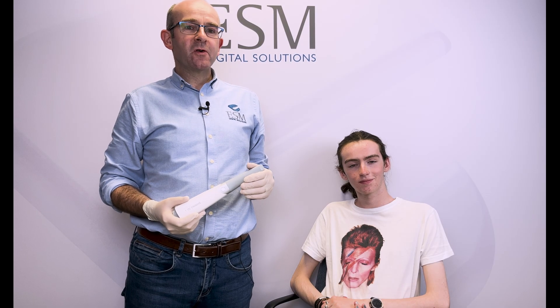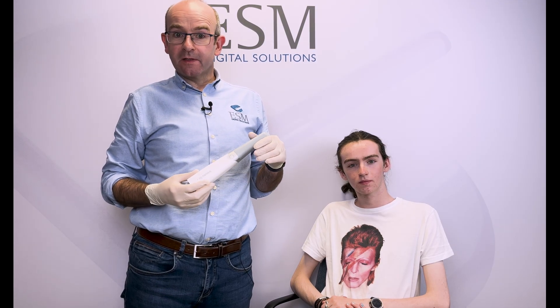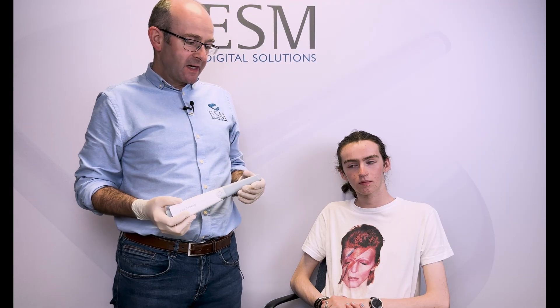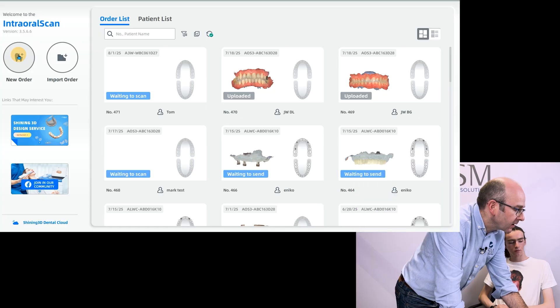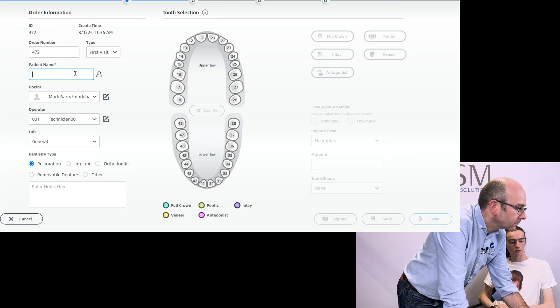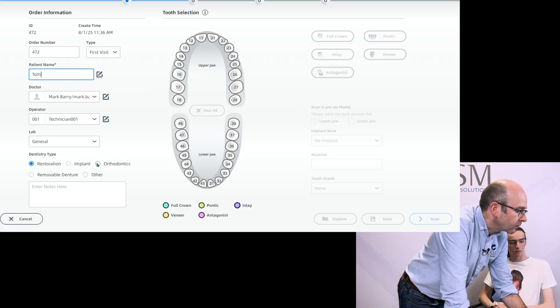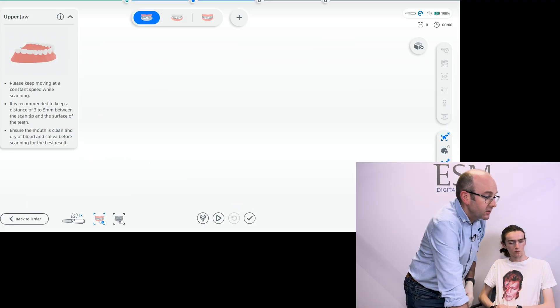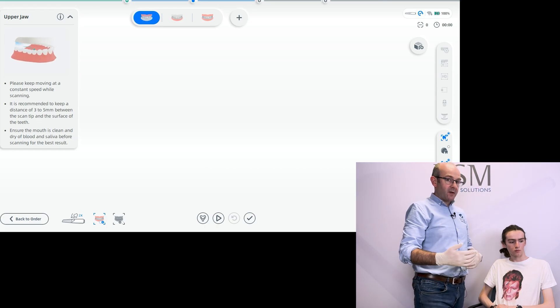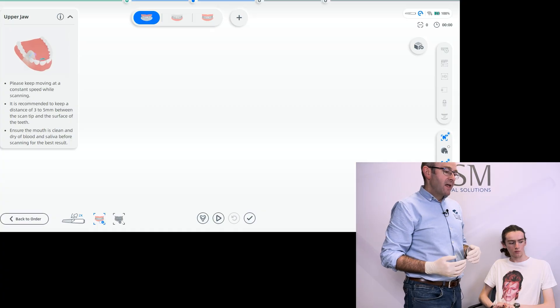In this video I'd like to walk through a standard scanning strategy using the Shining 3D Aoral Scan 3 wireless intraoral scanner. We've got Tom with me here today, so I'm going to pop his details into the software and select that it's an orthodontic case, purely to allow us to scan the upper arch, the lower arch, and the bite — the upper arch first, then the lower arch, and then the bite.